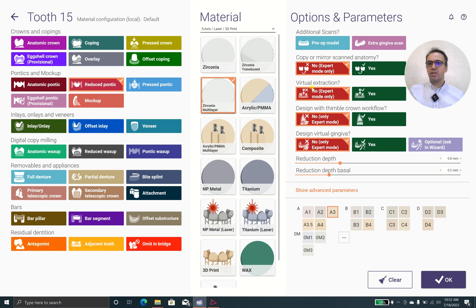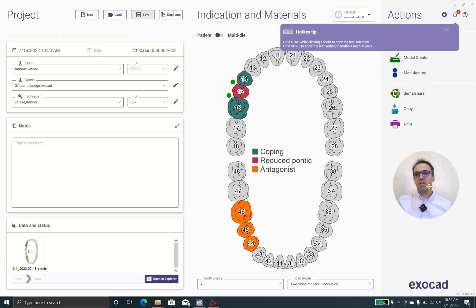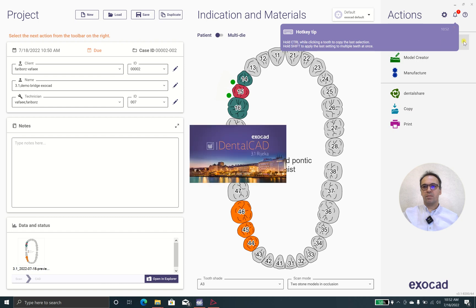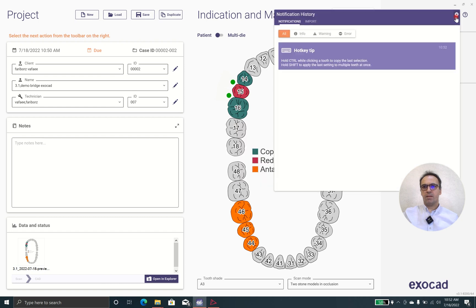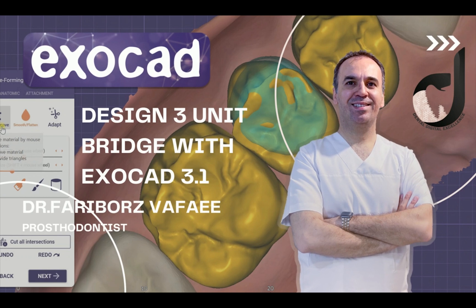The virtual extraction — yes, that's the point. Because as I showed you, we have tooth 1.5 and we have a scenario where we are going to cut that tooth off. The hot key: Ctrl with duplicate, Shift to apply multiple at once. Very good, great job.